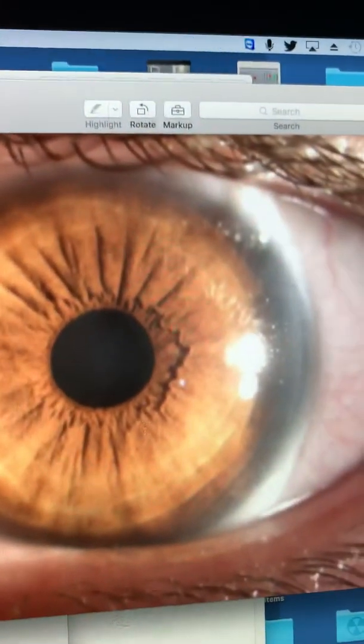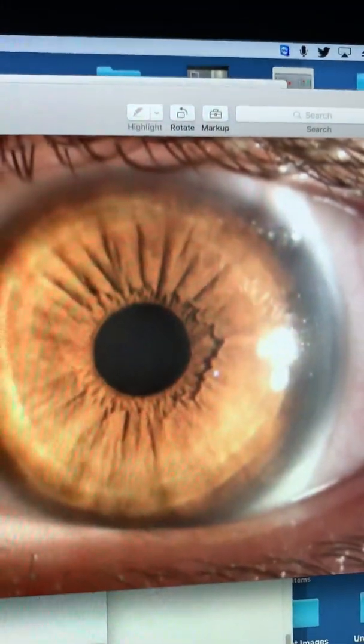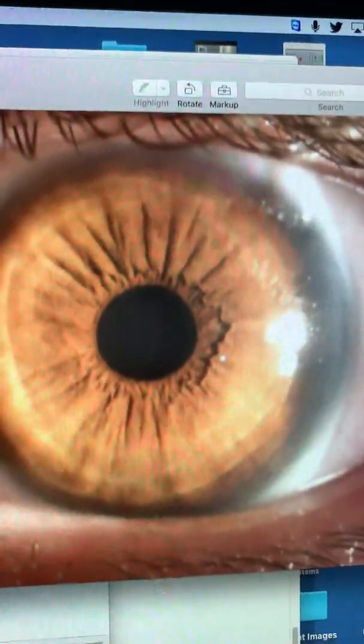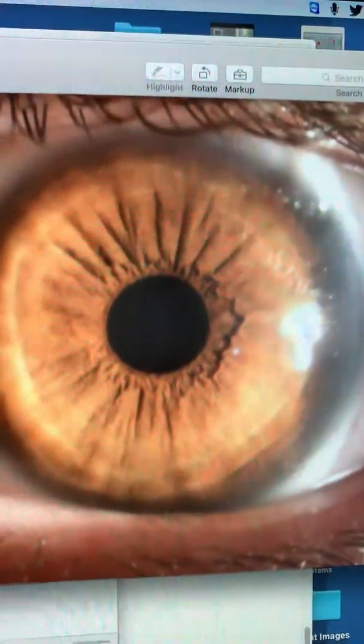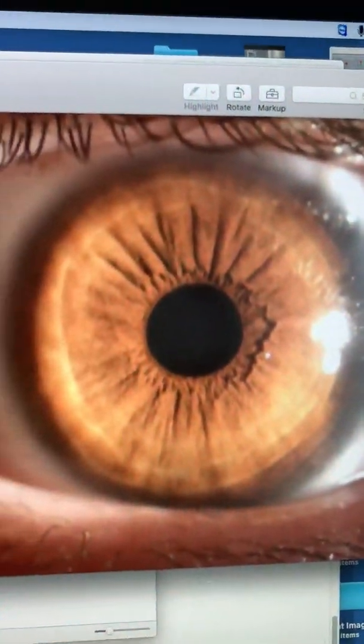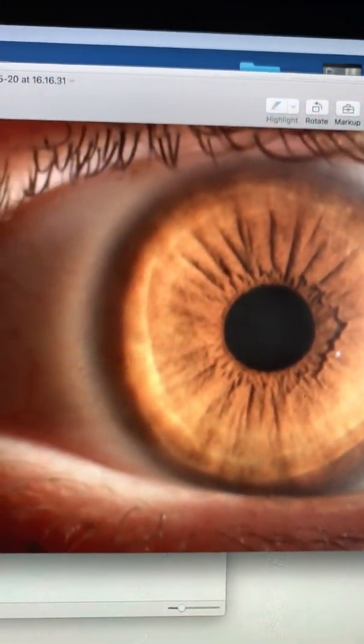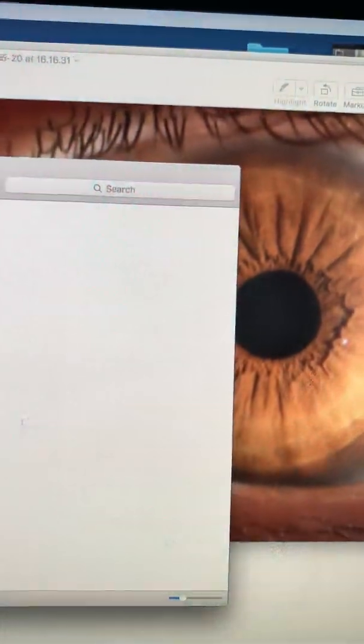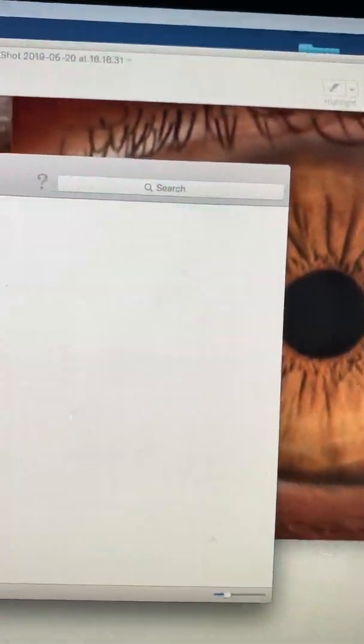This is his left eye, which is uncorrected 20/20 plus. We're going to look at his pre-op topographies.